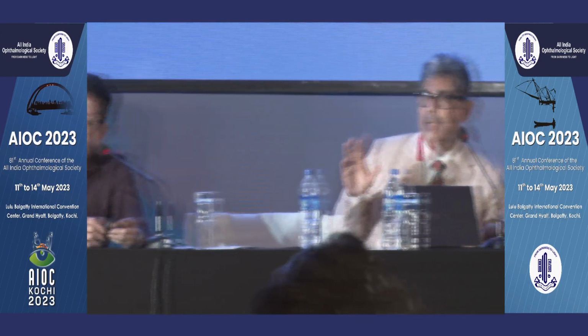As you also know, these myopes are prone to early cataract. So if it's a nuclear sclerotic cataract, then it's really not the lens which is at fault. It's just that high myopic patients are prone to these cataracts, in which case you have to handle it. So it's only those that are directly because of your ICL proximity, and if you see that opacity, that is when you'll intervene early. Absolutely. Anterior subcapsular opacity is usually a fibrotic opacity. And even when it is early anterior subcapsular opacity, we can wait till it is not obstructing their lifestyle.